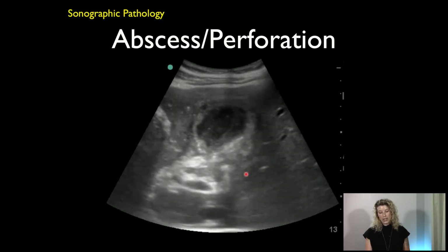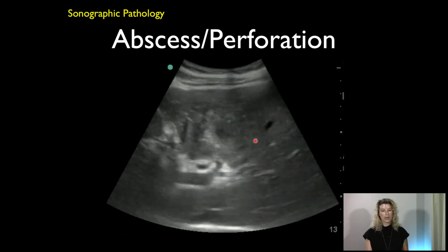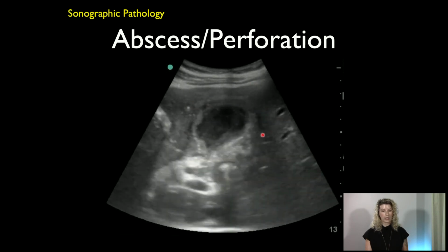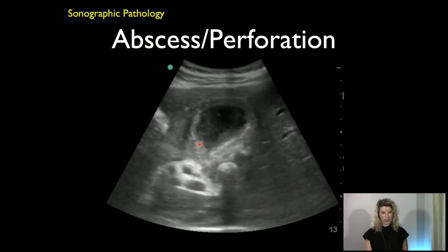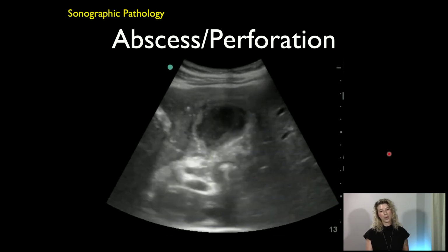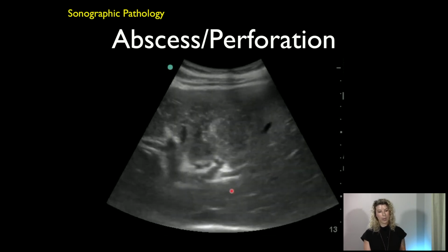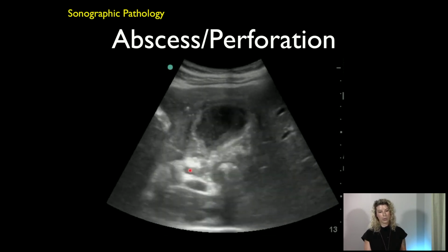This was a patient that had acute cholecystitis that waited so long that actually all of this garbage around it, it's so murky, and I don't think this looks like a normal shaped gallbladder, right? So this was actually a patient that wound up having a perforated cholecystitis. Look at the common bile duct over here, it is super large.